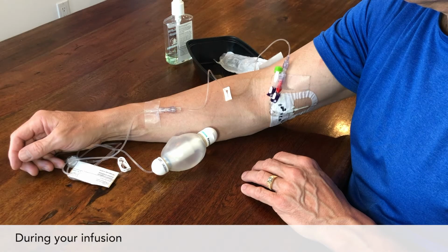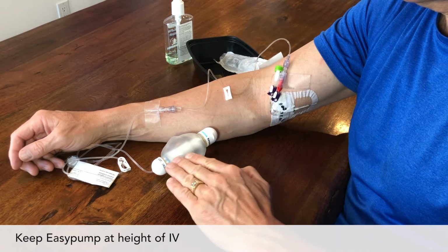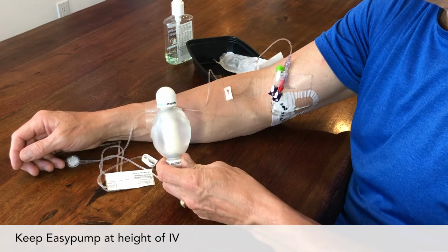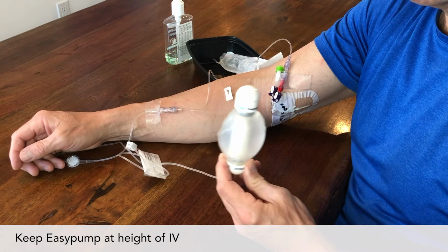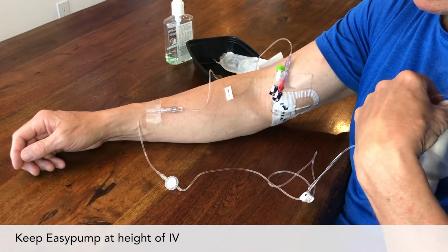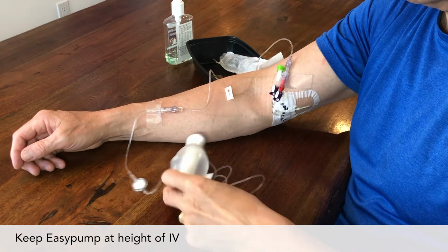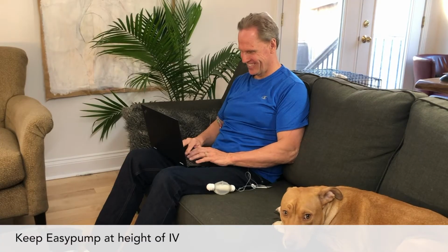Now, where should the pump be when it is hooked up? Place the pump at about the same height of the IV or PICC. You can carry it, put it in your pocket, or put it in a carrying pouch. Do not put it on the floor or hang it up high, as this change in height will change the speed of the medicine flow. You can now go about your daily routine.